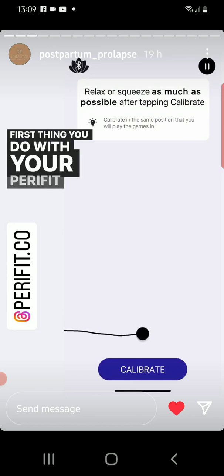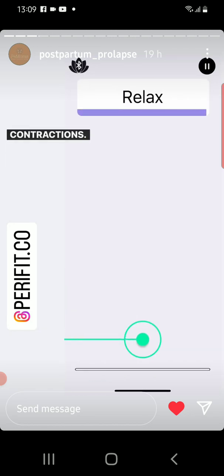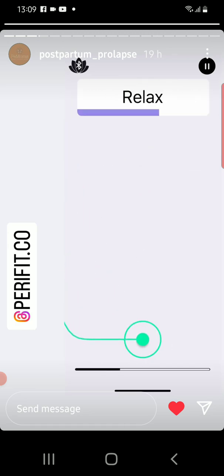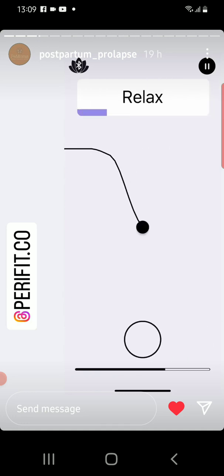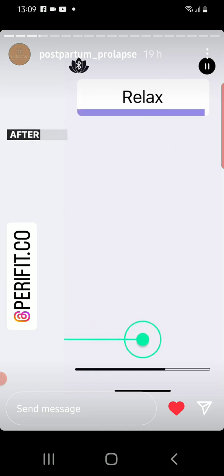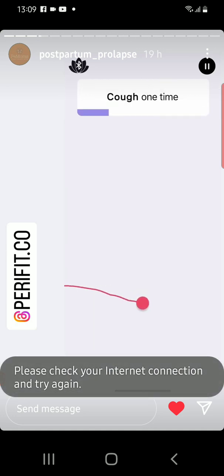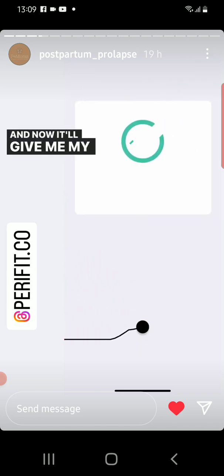The first thing you do with your Perifit is calibrate it. So you're going to do a series of relaxations and contractions. After this, it's going to ask you to cough once. There's my cough, and now it'll give me my strength assessment.